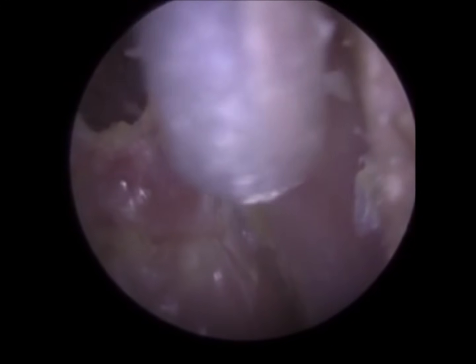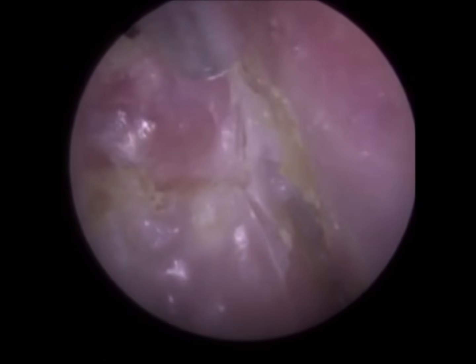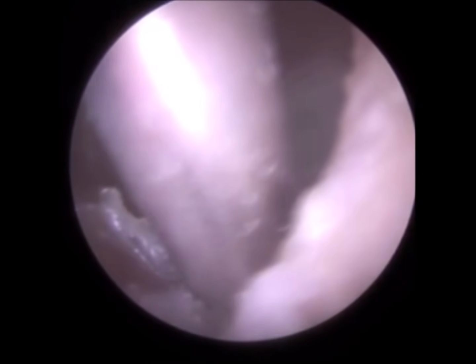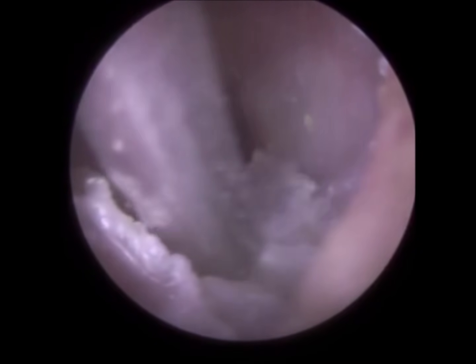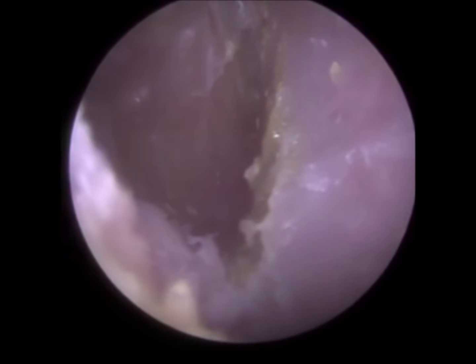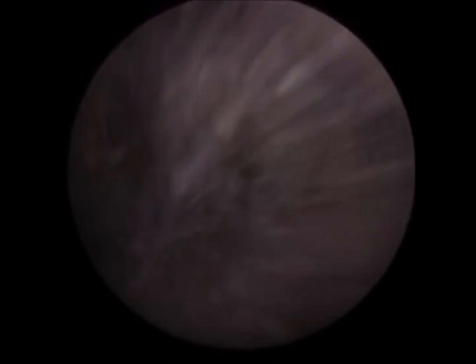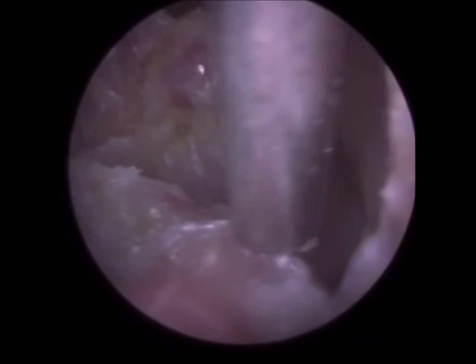So we're just near the entrance, got this dead skin there, and you can just see this hollowing of the ear canal, the erosion. That's very, very deep into this tympanic plate, the base of the ear canal. It's probably going to require a very strong dose of antibiotics in the first instance to stem any infected bone, so it can preserve as much bone as possible. He's obviously going to need his ears clearing out regularly now because that crater is a perfect breeding ground for dead keratin and wax formation.